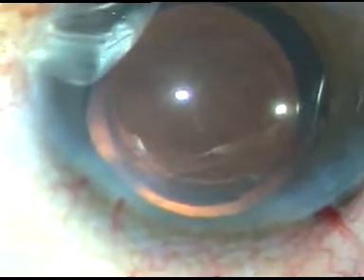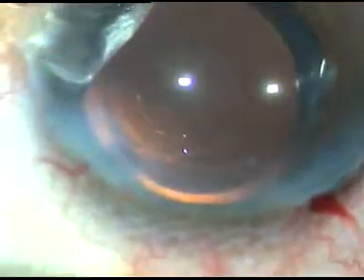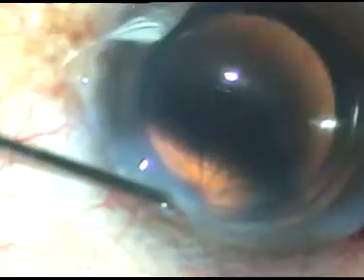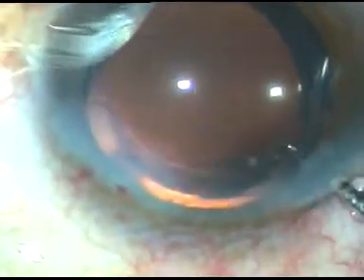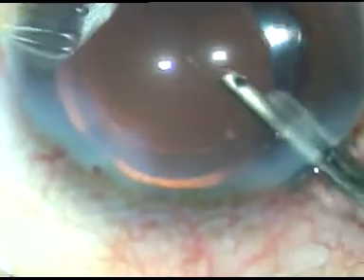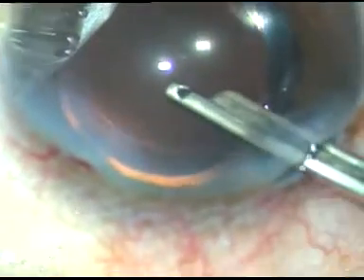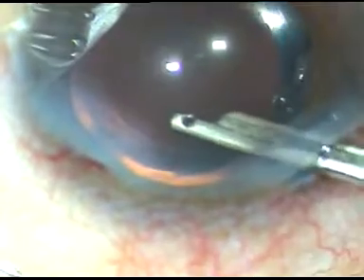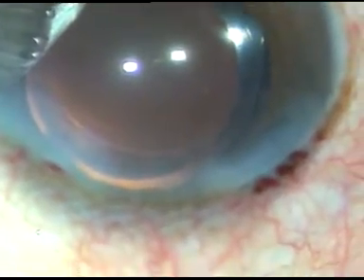Friends, the main challenge in intumescent cataracts is not the other steps — all steps are routine except the capsulorhexis part. Always do a small rhexis first, aspirate some lens matter, decrease the intralenticular pressure, and then enlarge the small rhexis into an optimum-sized one. Once the anterior chamber is nicely formed, conclude the case. Thank you.